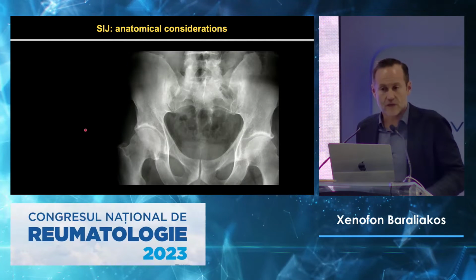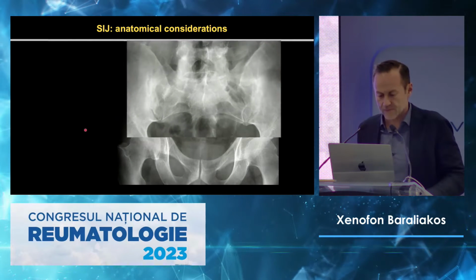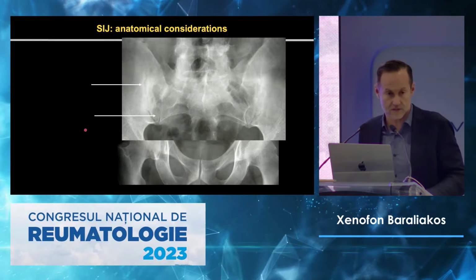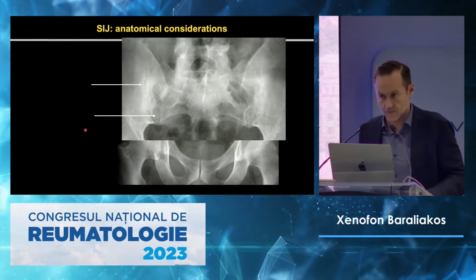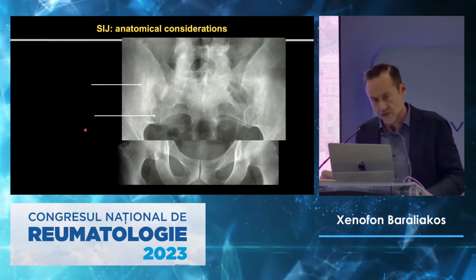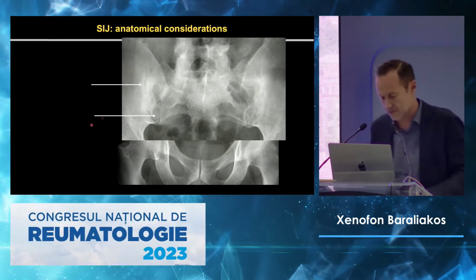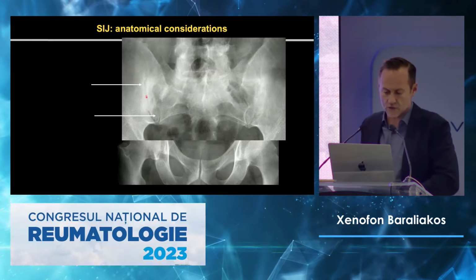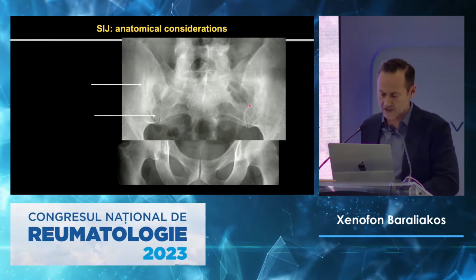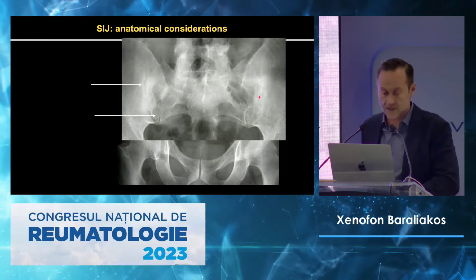One other thing we need to take into account is that we may have different lines that we see on that sacroiliac joint. And again, I'm not wasting our time with X-rays now. I'm using this for showing the MRIs later. So the question is, are you looking into this, or are you looking into this line here? Yeah, the same here. Is that the line you're looking at, or is this the line you're looking at?